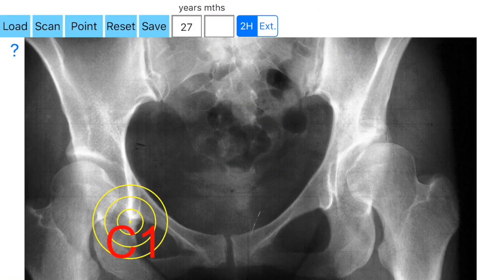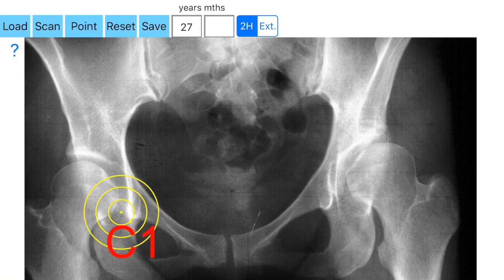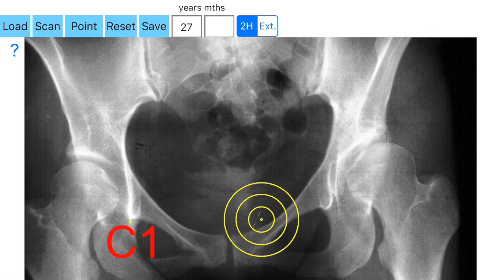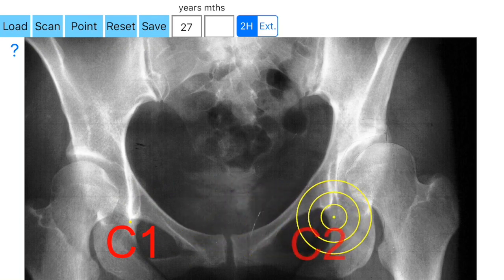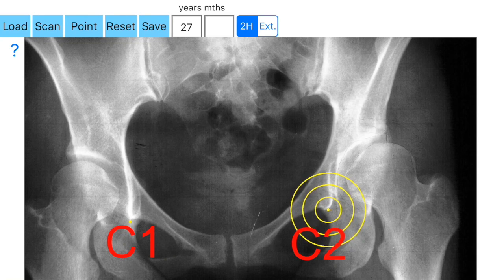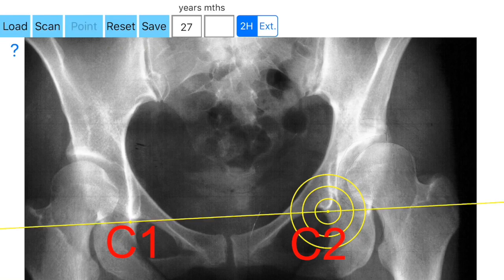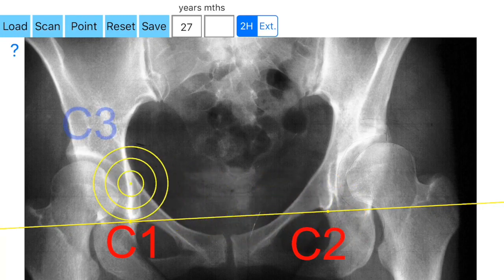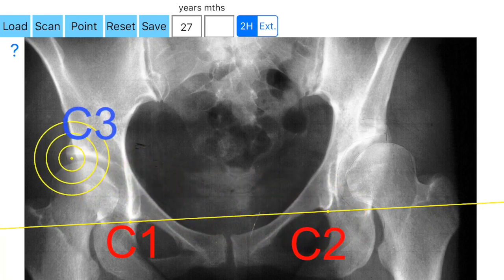The app offers a template that appears, and you aim to locate the right teardrop by moving the template. By clicking the point option, the first point of measurement, C1 right, appears. By repeating the same task you locate the teardrop of the left hip, C2 left. After that, a horizontal line C1-C2 is drawn. Now you are ready to mark first the right lateral acetabular border, the third point C3 right, by pressing the point option.